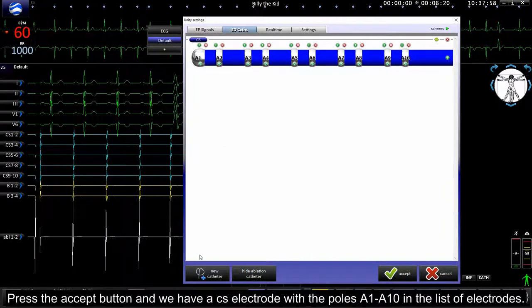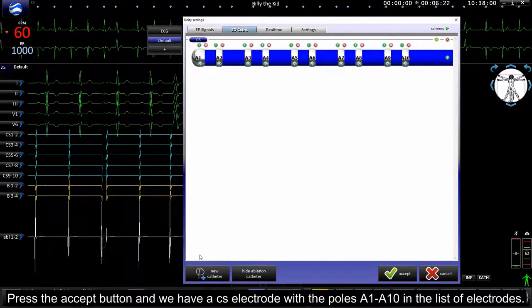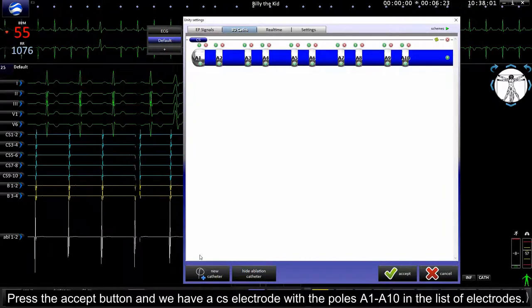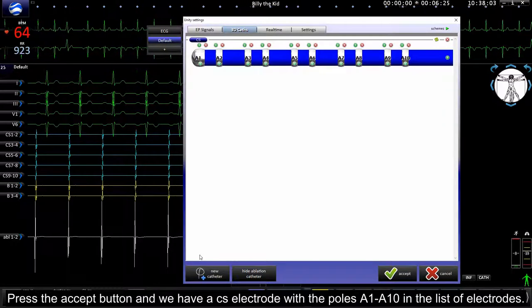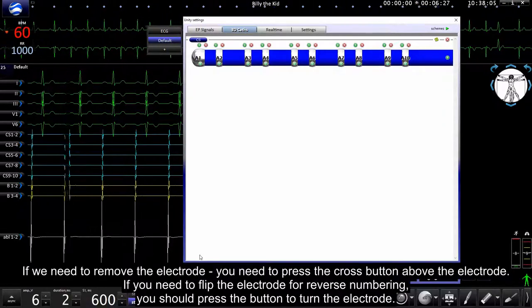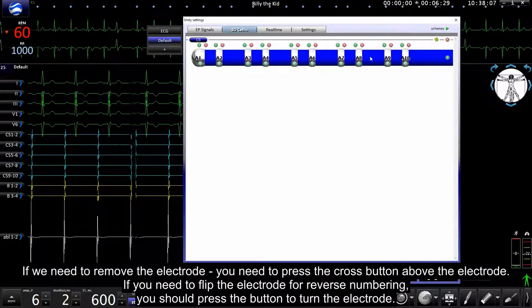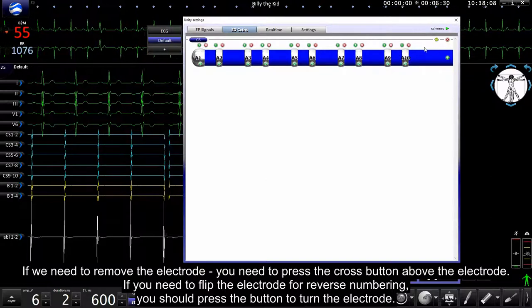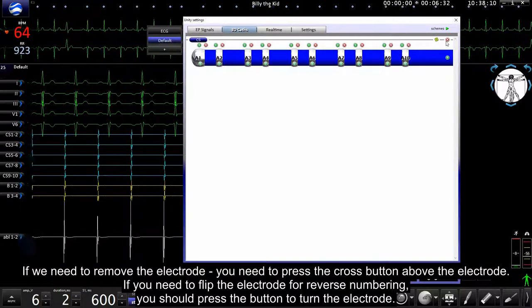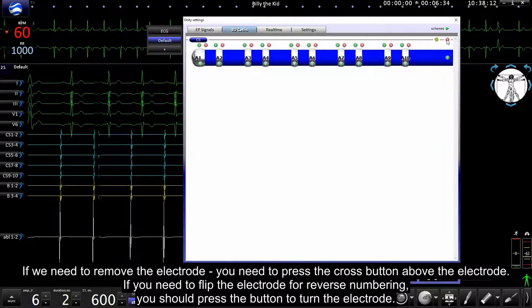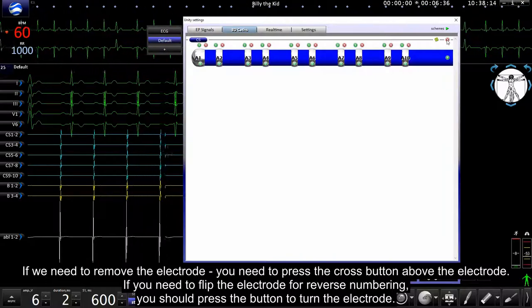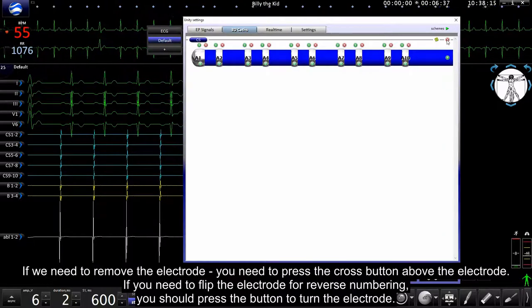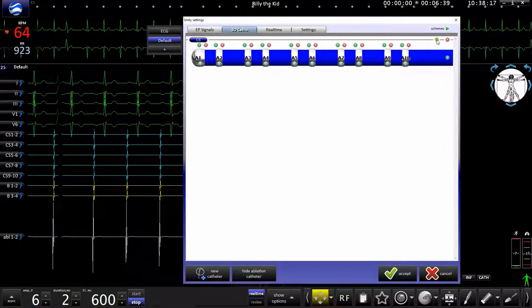And we have a CS electrode with the poles A1-A10 in the list of electrodes. If we need to remove the electrode, press the cross button above the electrode. If you need to flip the electrode for reverse numbering, you should press the button to turn the electrode.